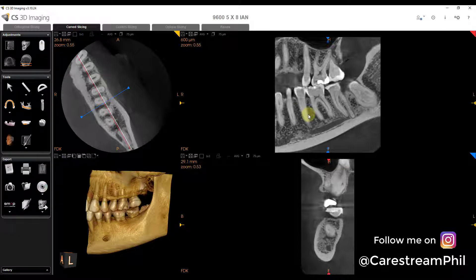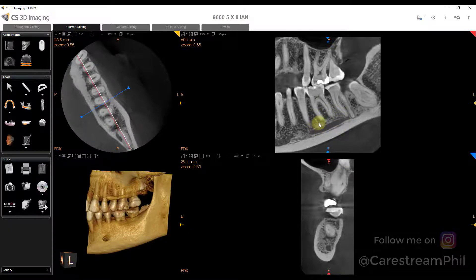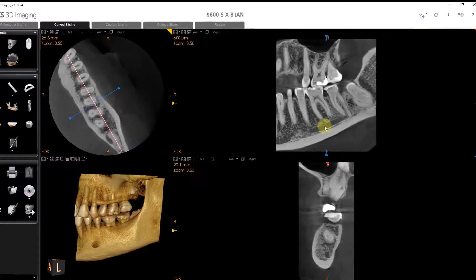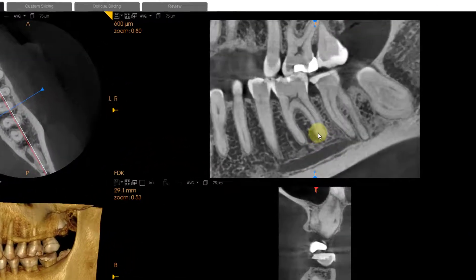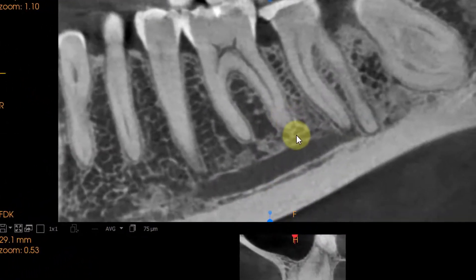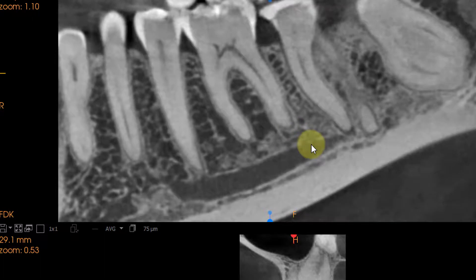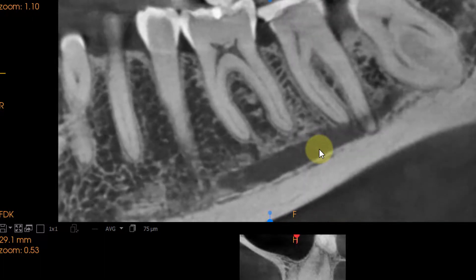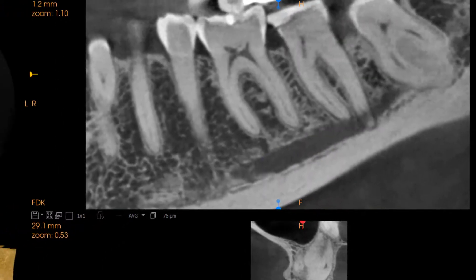So you can leave this mouse icon closed, and instead of going back and forth there, just use your opposite mouse hand. I'm a righty, I'm using the mouse with my right hand, and with my left hand I'm just selecting Ctrl A. Now I can zoom in, select Ctrl A again, and now I'm slicing through. It really makes it a lot faster to go through a case.